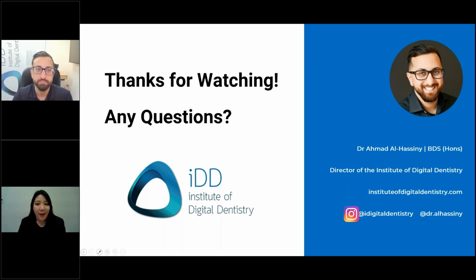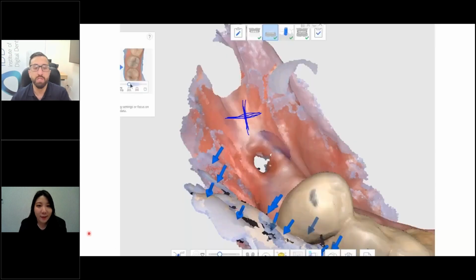I see. And question number 3: it is too difficult to scan soft tissue between implants. When I'm scanning the emergence profile, it literally stops, loses focus and can't continue. Just like the image this user sent. Any tips? Yeah, so this user sent this image about how hard it is to scan the implants, and this is basically the first step of implant scanning. Before you place the scan bodies, you have to take off the healing caps and then scan the emergence.